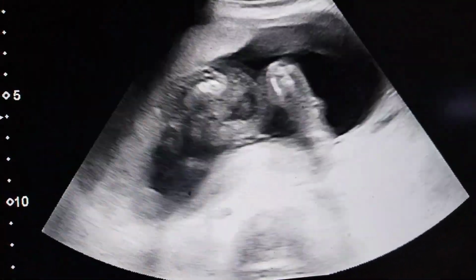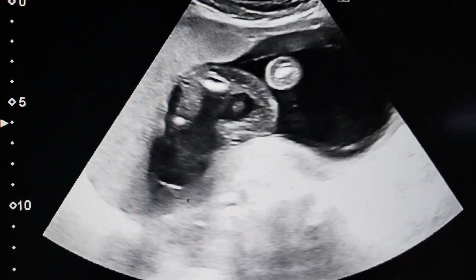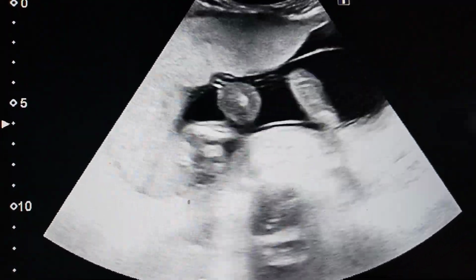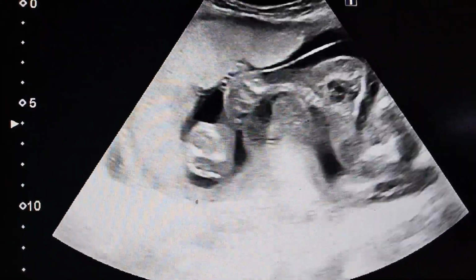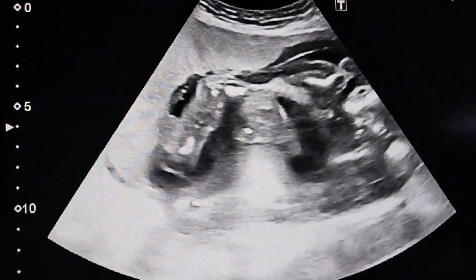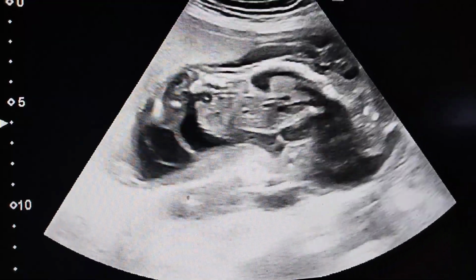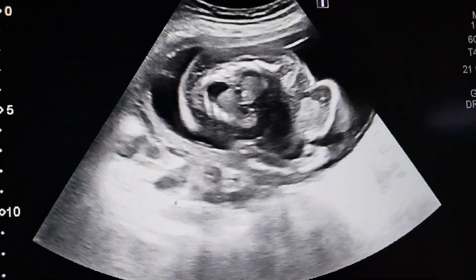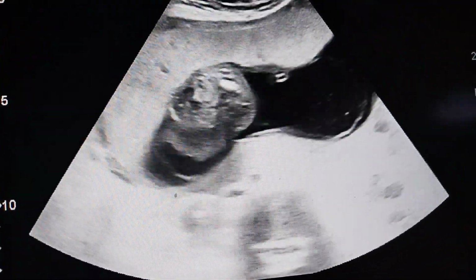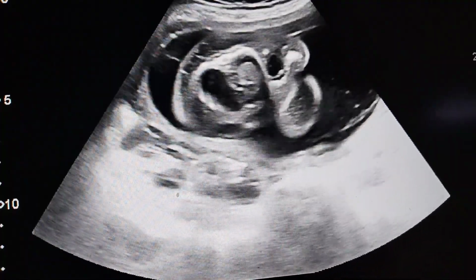Here I have seen that there is no such pathology within the fetal heart. Then third is there may be thalassemia major in the fetus, usually alpha, that can cause low plasma protein, and then anemia, and then fluid.